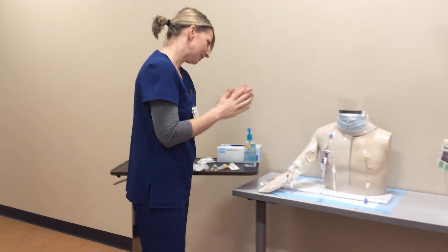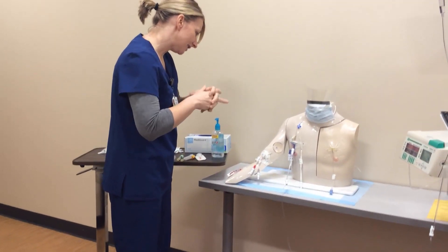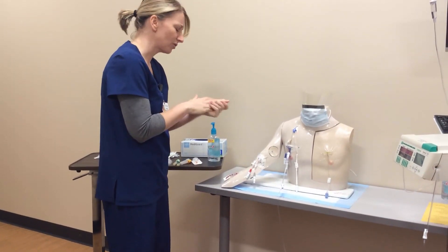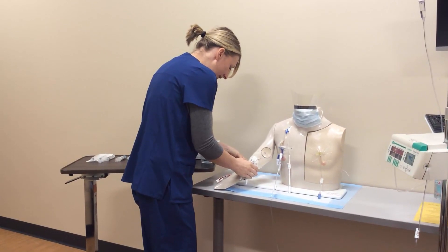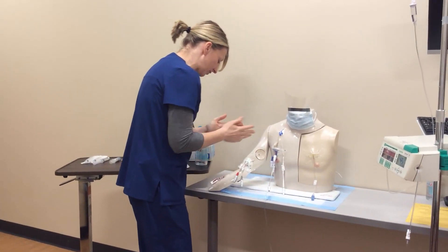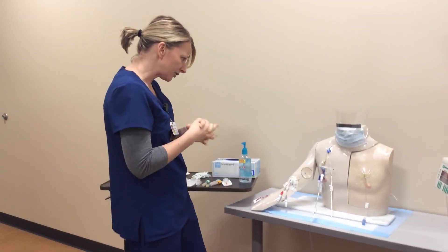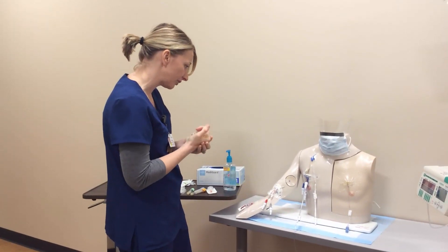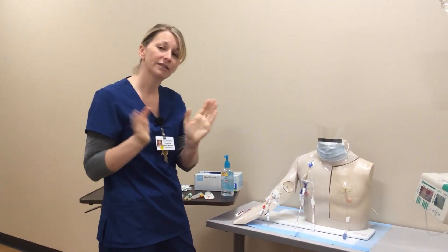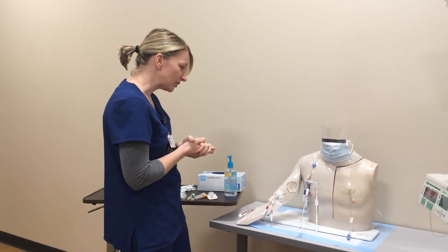Knock knock. Hi Dan, my name is Christine. I'm going to draw blood from your central line today. Can you verify your name and date of birth? He says Dan Brown, date of birth 7/5/2007. It matches your wristband. The doctor has ordered blood to be drawn from your central line. Have you ever had blood drawn from your central line before? He says yes, tons of times.